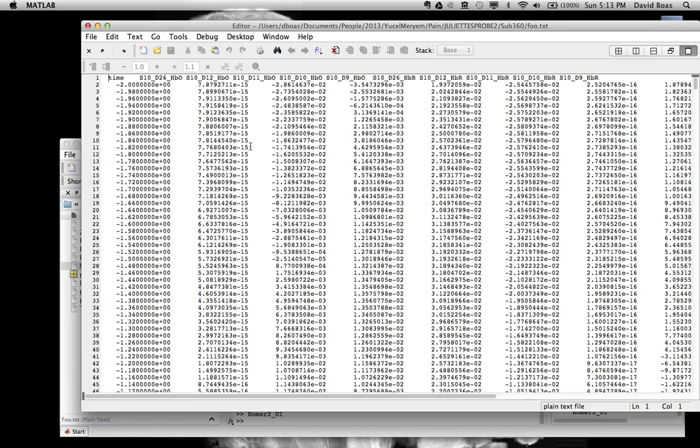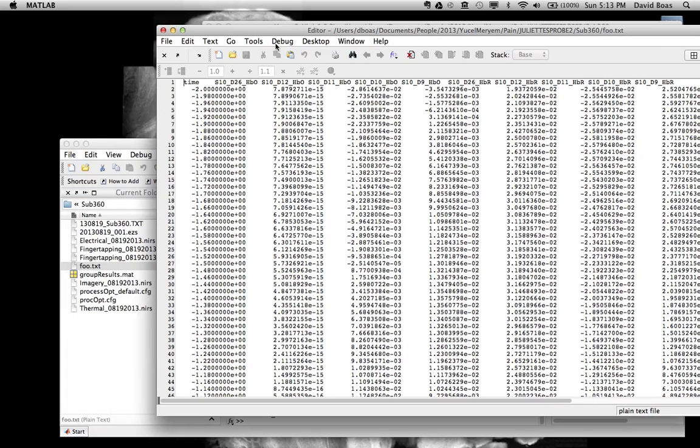Now you see you get multiple traces of data. They're all labeled. Different source detector pairs. Oxyhemoglobin. Different source detector pairs. Deoxyhemoglobin.